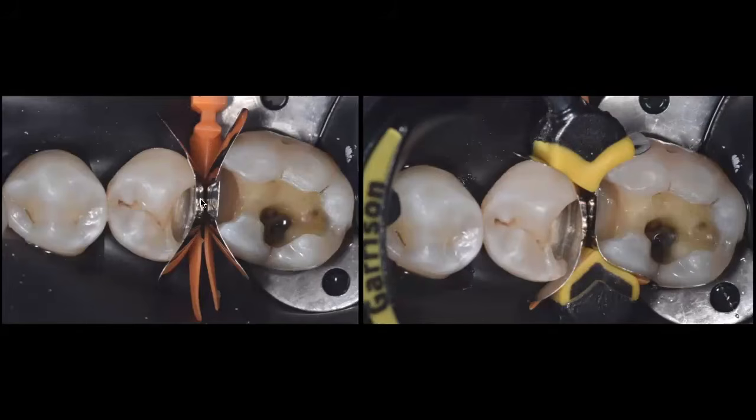Now you can see that this medium quad wedge works very well with this quad matrix ring. The quad matrix ring is either blue or yellow. The blue is a shorter one, the yellow is a taller one. The reason why I chose the yellow is that I have very wide and deep proximal boxes, so I want more of this rubber tip surrounding my band, so that I can recreate the ideal shape of these proximal buccal and lingual embrasures.